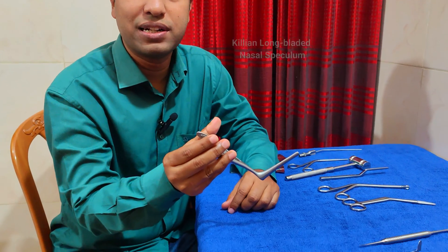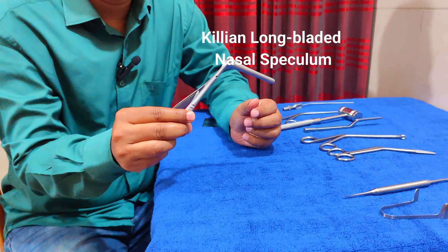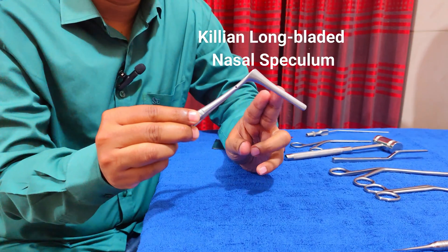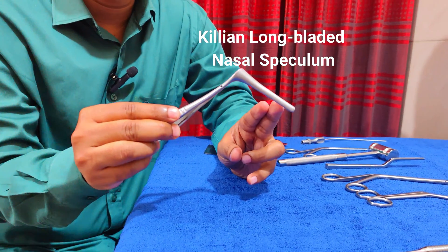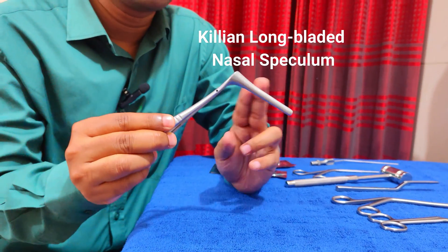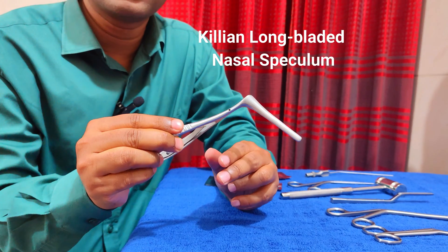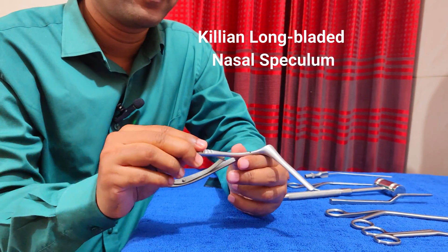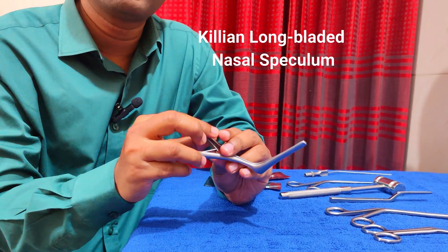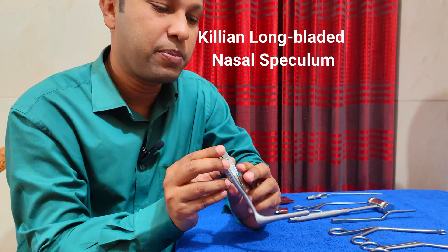This one is the Killian's long-bladed nasal speculum. The Killian nasal speculum has different sizes of blades, and this one is the long-bladed Killian's nasal speculum. After raising the mucoperichondrial or mucoperiosteal flap, we insert it into the nasal cavity.